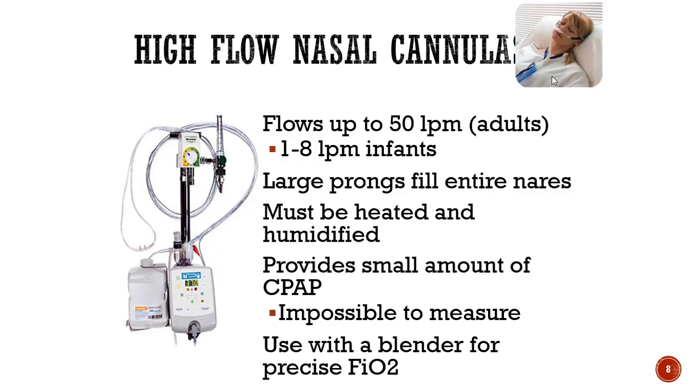You're also looking at larger prongs. When you are on a high flow nasal cannula, it makes sense to have these larger prongs, because the whole goal of this device is to have all of your flow coming from the O2 device itself. You want to be meeting the patient's inspiratory flow needs, so you want the prongs taking up more real estate in your nostril so that they are able to do that more effectively.